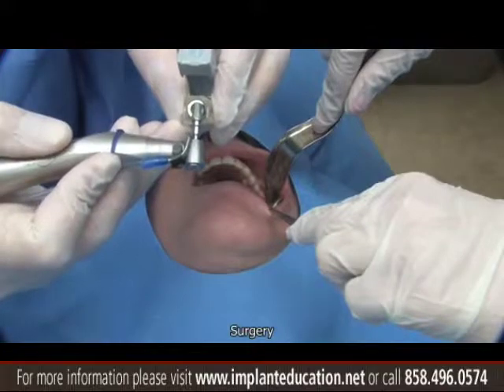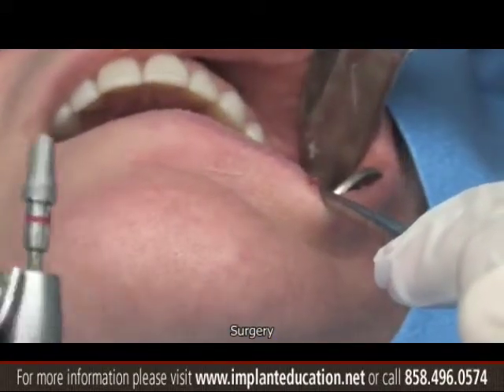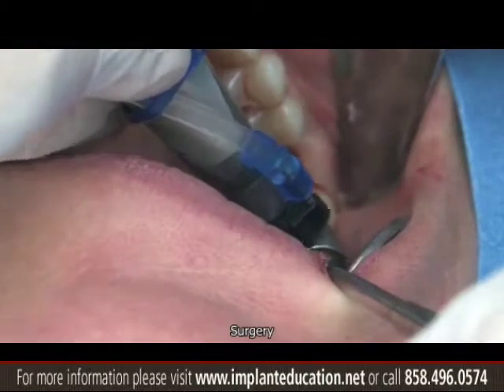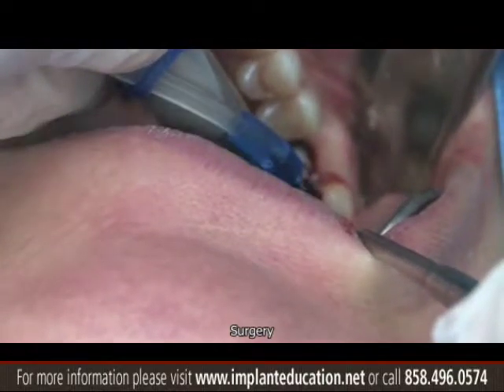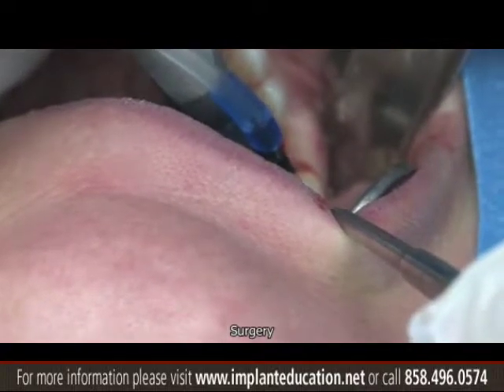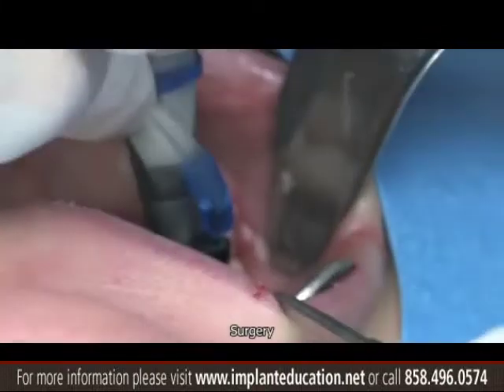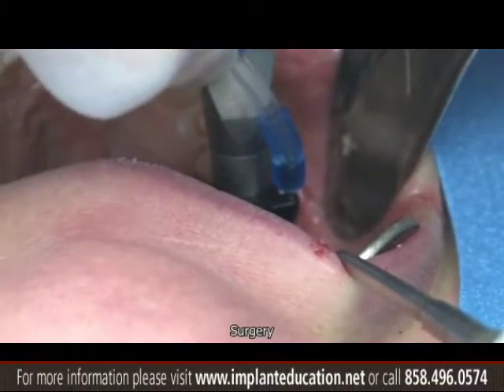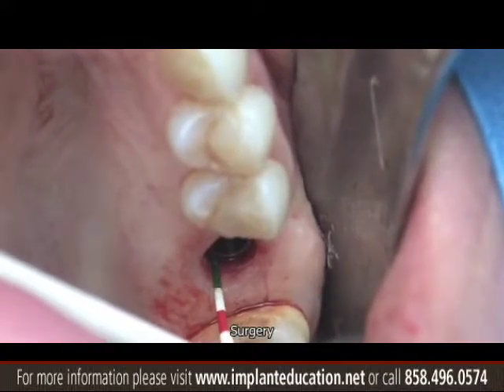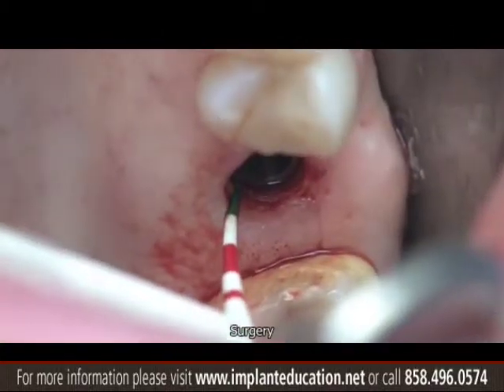We shut down the irrigation, lower the speed, and set the torque to 35 Newton-centimeters in the machine. We place the implant all the way until we have a good 2mm of soft tissue coverage above the implant platform. With the perio probe we can see just under 3mm of soft tissue coverage or thickness above the implant platform.